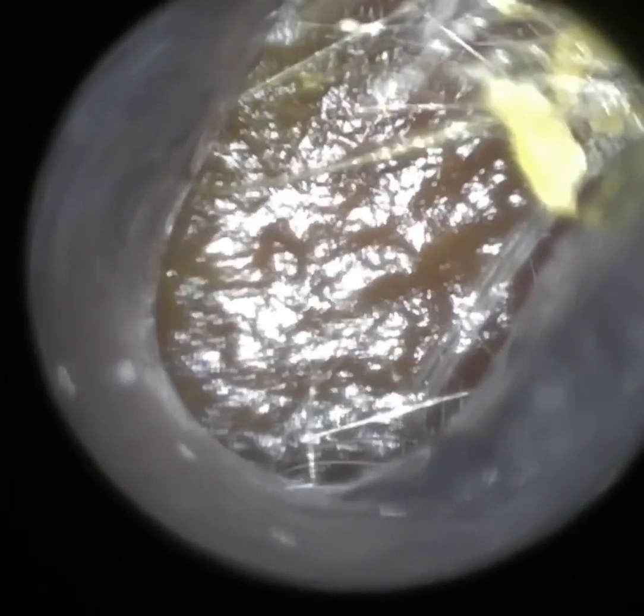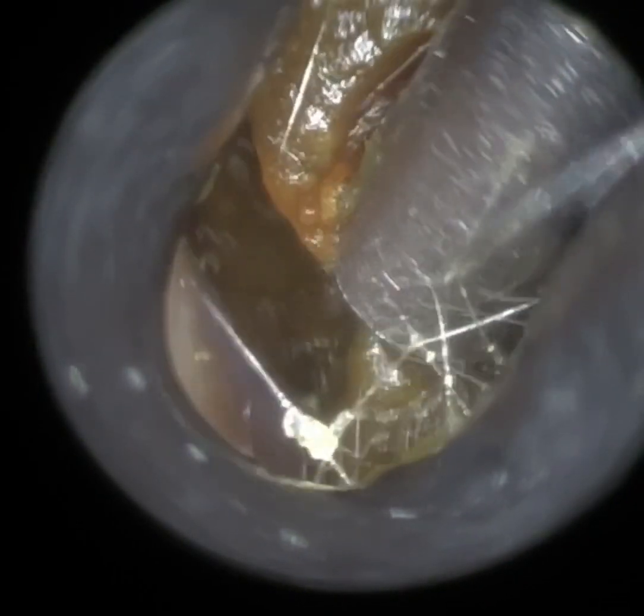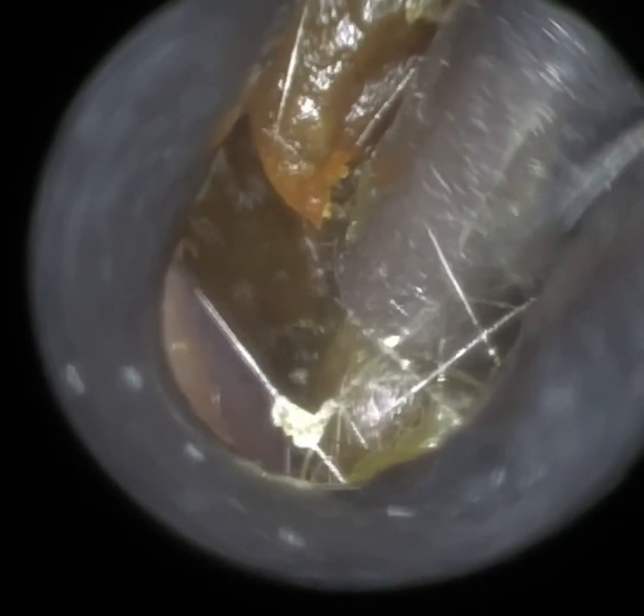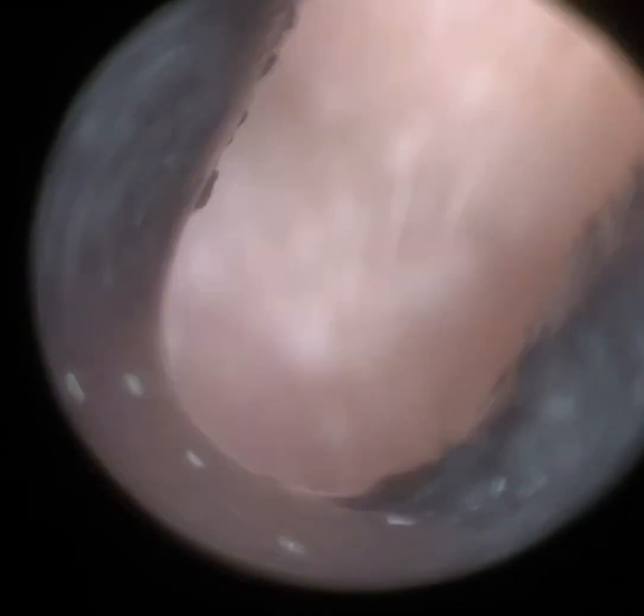This is the patient's left ear. The wax in this ear was a bit stickier, at least the surface was, and again just near the entrance I'm going to lift this off the base of the ear canal. It was a bit too glutinous and sticky, so I decided to put some olive oil spray straight away, just using the speculum there to dilate the ear.